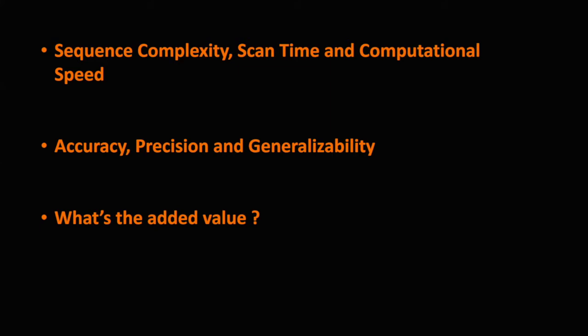The scan time can be long if we are going to scan a large tissue. If we need large tissue coverage, of course, MRF also requires relatively higher computational power to create the dictionary and generate maps. It's also challenging if we really want to make sure that all the maps are generated in real time after the scan, so that this protocol can be incorporated into a busy clinical workflow.